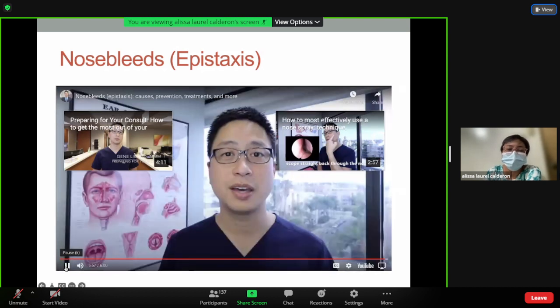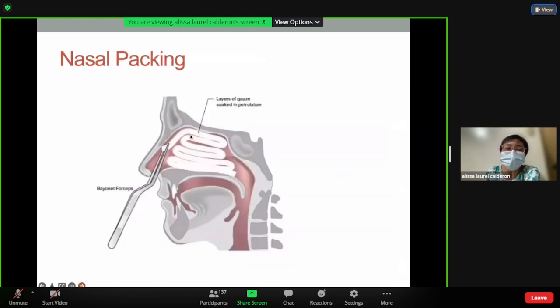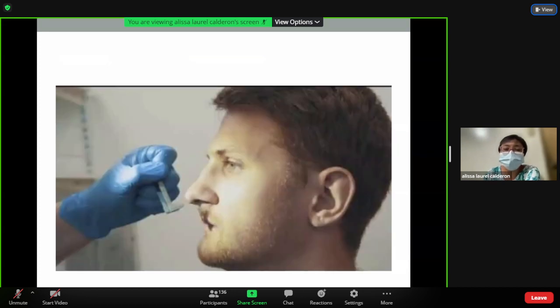Okay. So actually, this is how they do the nasal packing. You don't need to do that during your OSCE. Probably they can just ask you how to go about it and that's it. But they will not ask you to do it.